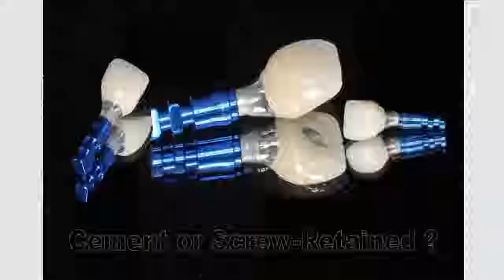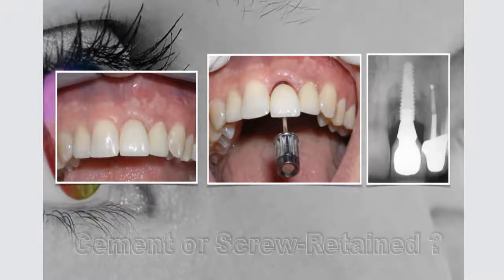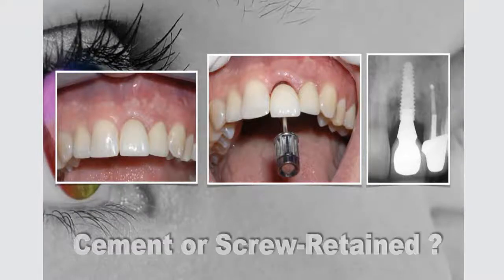Patients are coming to us not for implants, they're coming to us because they want teeth. And so when we look, side by side, it's basically very hopefully indiscernible which is the implant, which is the natural tooth. And in this case, this was a screw retained restoration. Nice emergence profile, good maintenance of the crestal bone, and the implant goes beyond the apex of the adjacent teeth. So this is part of the goal that we want to achieve.